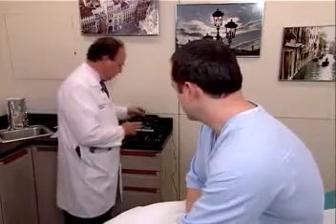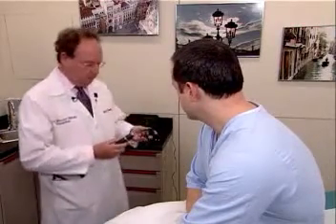One of the most important parts of the physical examination is the ophthalmoscopic examination, providing us with a wealth of information about the patient's health. This is the only non-invasive means of directly viewing vasculature in its native state. I'm going to demonstrate the use of the ophthalmoscope by using 3 different types of equipment. The first is the standard direct ophthalmoscope.